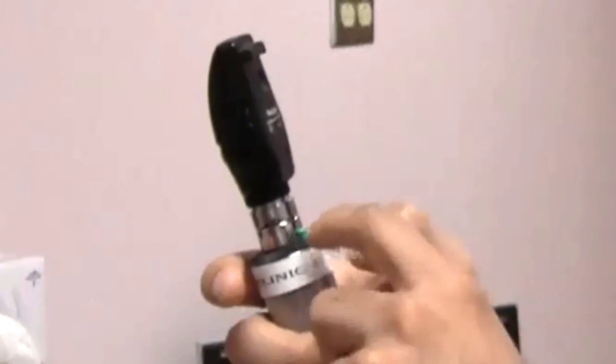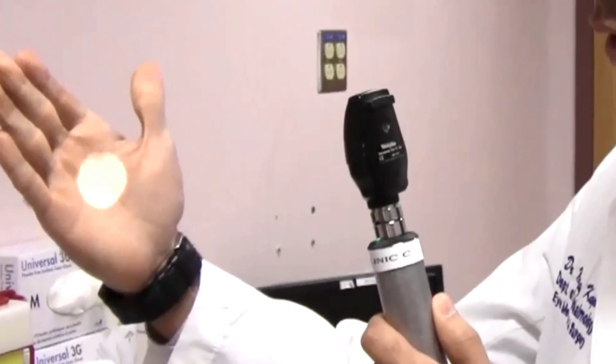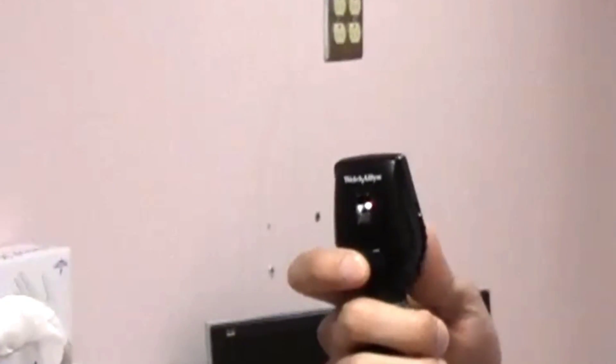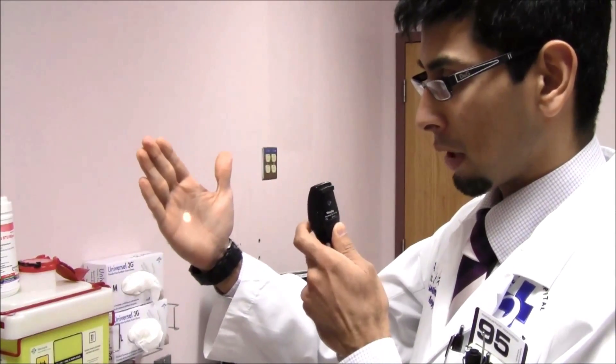The way to turn the instrument on is a little green knob. You depress it and rotate, and it turns the light on. As you can see, the illumination is present. There are a few options on the front here to rotate to change the illumination. I'll show you what each of the options does.